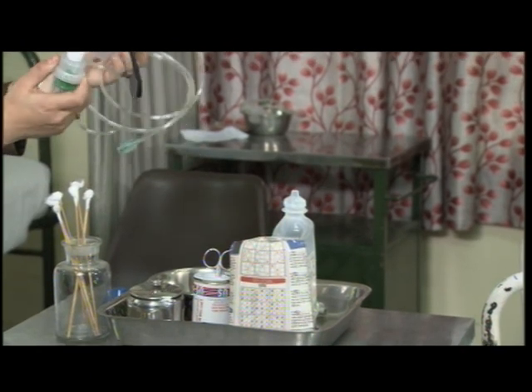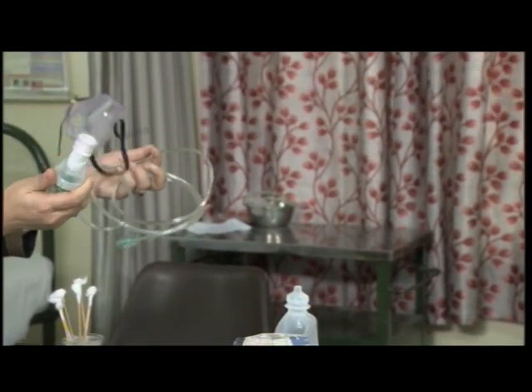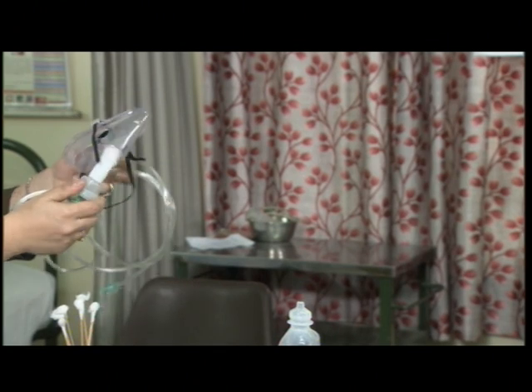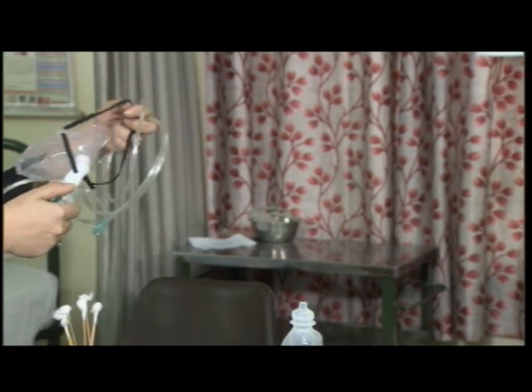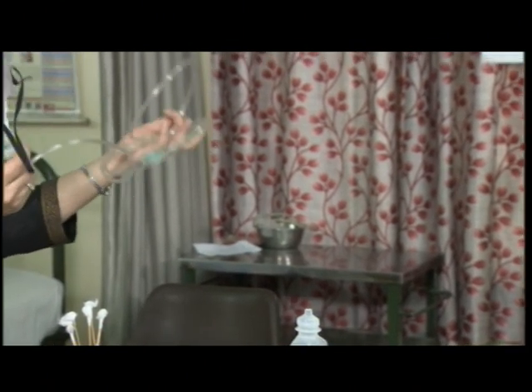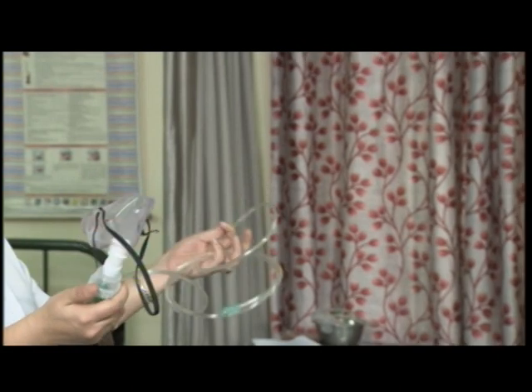This is the face mask which we are going to apply on the patient. It should be clean and with the tubing intact, without any break or kink.